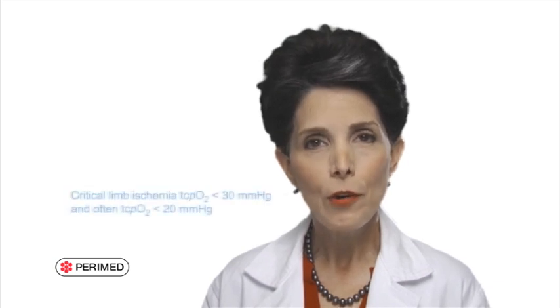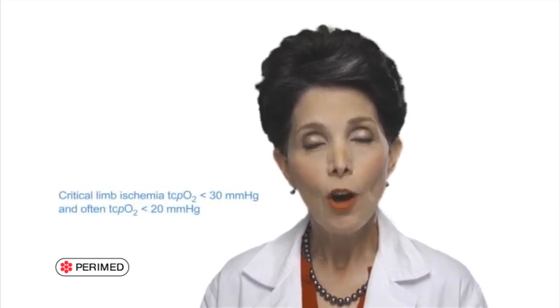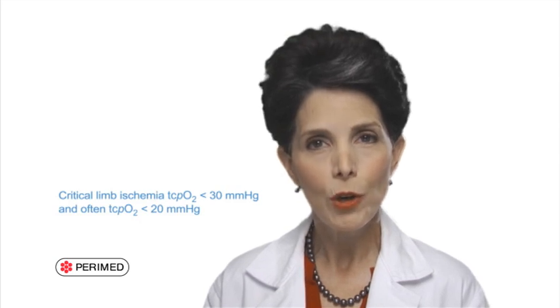Now let's discuss screening for vascular disease, or assessing the success of revascularization. Patients with critical limb ischemia will almost always have a tcpO2 less than 30 millimeters of mercury and often less than 20 millimeters of mercury. However, as we've already mentioned, low pressure values can also have other causes. So how can you know if the low values you see on a patient are due to arterial disease?